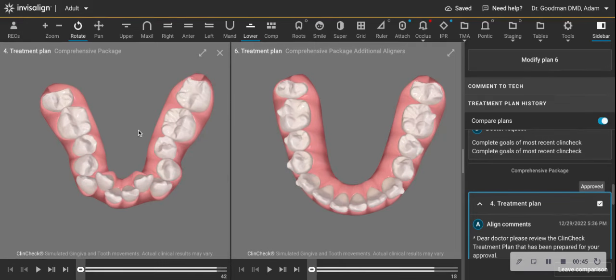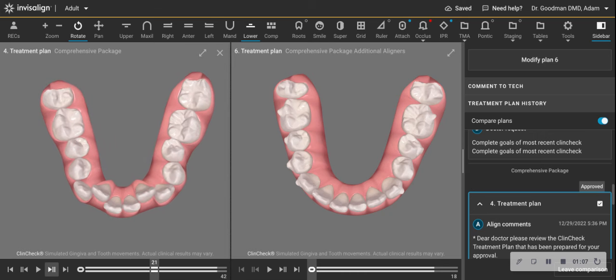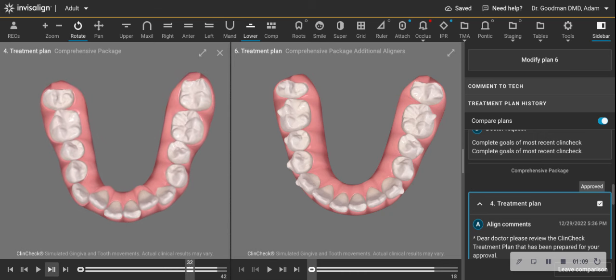And so here's severe crowding here, and you can notice how everything is inwardly displaced. Crowded, but inwardly displaced. The premolars are lingual. The lateral incisors are lingual. So I said, before we decide to extract, let me just see what it would look like if I expanded. Would I have to expand too much? Would the teeth be too flared forward or laterally in the final position?